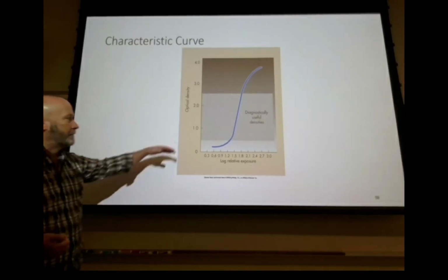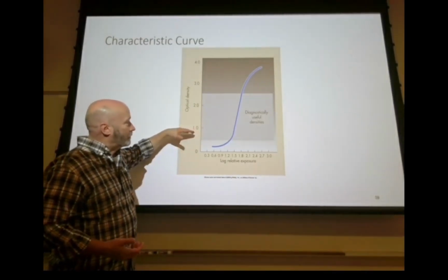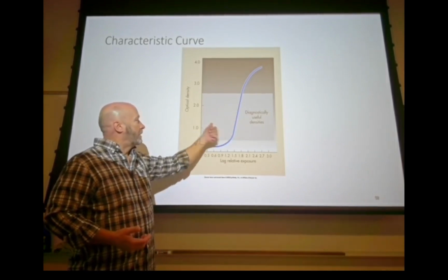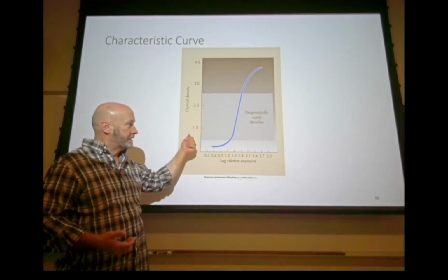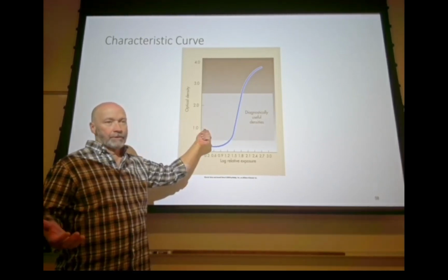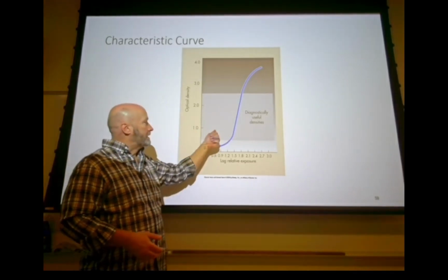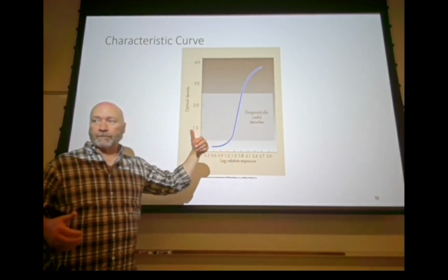of the imaging system, which is essentially where, I'm just going to say at this point in density, the vertical axis of the curve is. If I had two curves up here, whichever one was closest to the optical density axis at 1.0, and it's really 1.0 plus base plus fog, but that really has to do with screens and film, so it doesn't really have an application. So we're just going to say 1.0. Whichever one is closest to 1.0, that's going to be your faster image receptor, right?